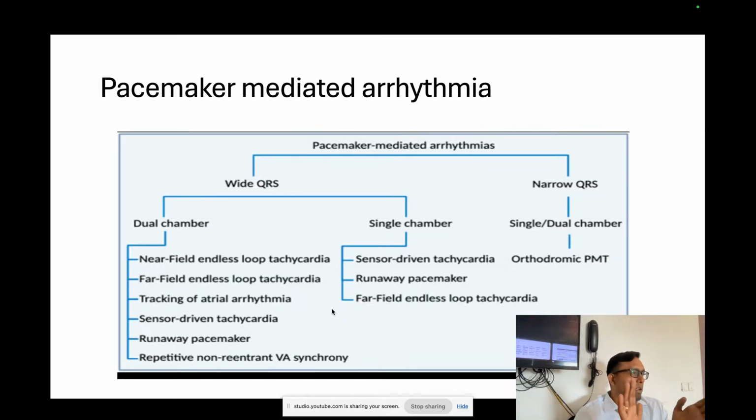And that should happen like a primary angioplasty. You should not wait, thinking okay, the patient will be shifted. You are seeing that the patient can die anytime. So there is no way out unless you cut the wire, or unscrew the wire, if you are not able to do it. So runaway is a medical emergency, a surgical emergency in the pacemaker.